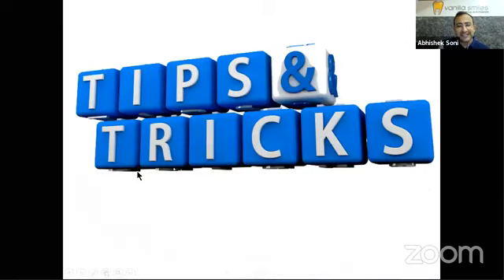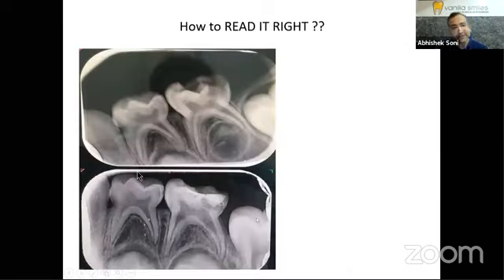So let's look at the tips and tricks. It's very difficult to cover everything, but it's important that we read our radiographs well. So what is it that we need to look at? First things first, your radiograph is going to help you decide what taper of file you're going to use. A lot of secondary dentine formation happens as the child ages from 3 years to 5 or 6 years of age. So when you take a radiograph for a child who is 3, you will see that the canals are wide. So you probably may need 4% or 6% taper files.